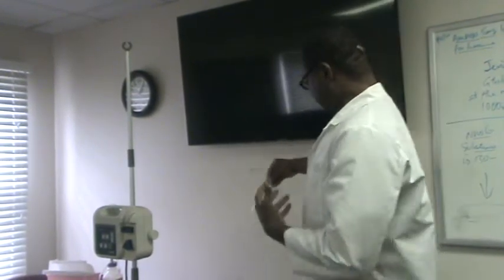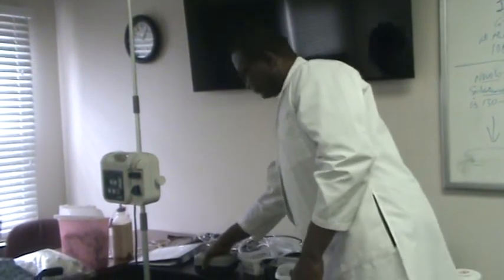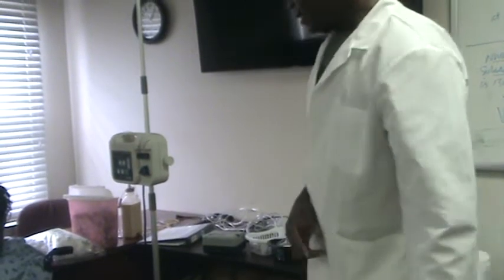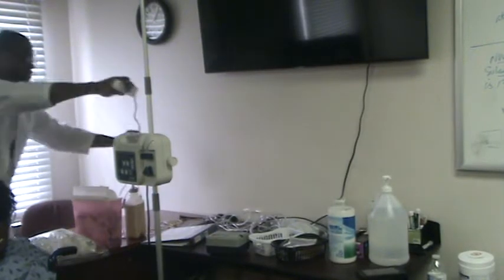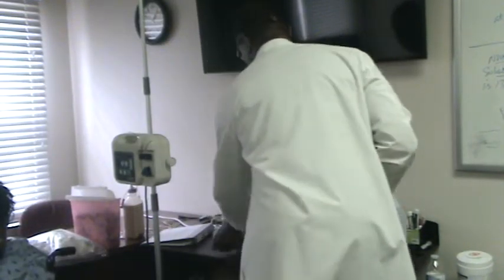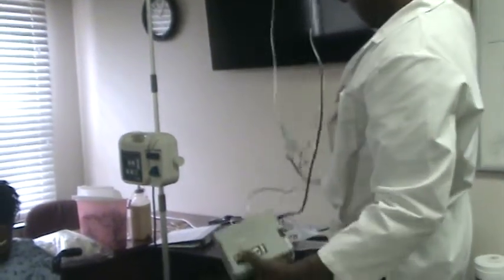Since we are on breathing treatments, let's go to nebulizer treatment. I need to connect the extension to connect the machine. So we're going to demonstrate nebulizer treatment next.